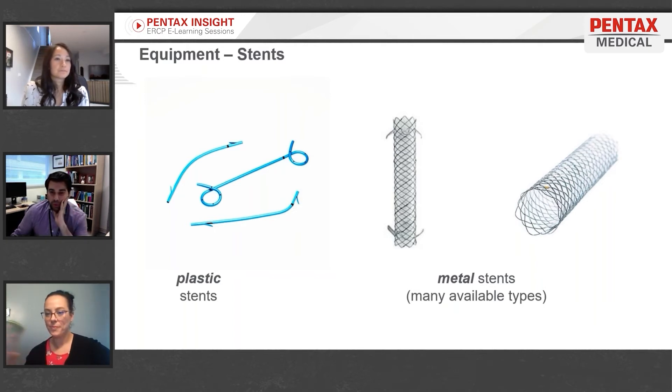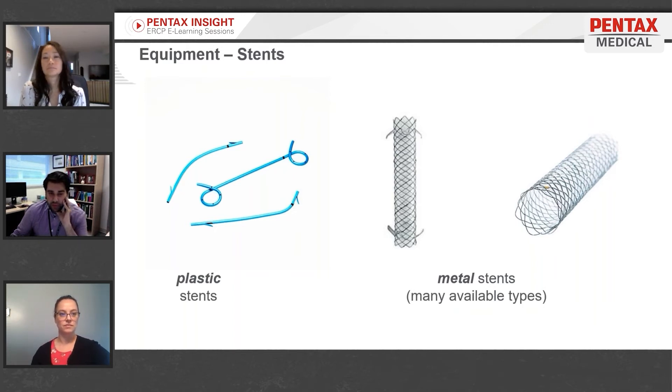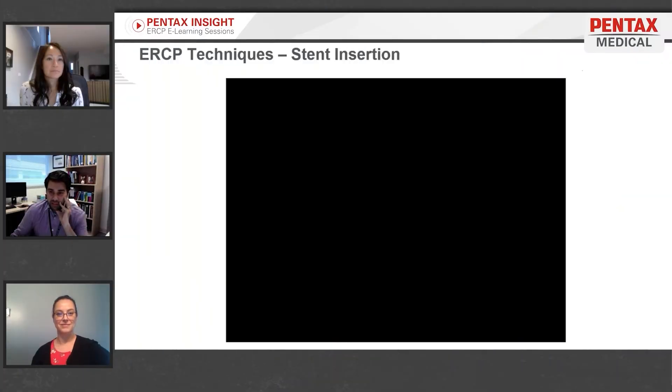This is ERCP 101 — there's tons of other equipment we won't cover today, just a basic overview of what you might encounter. Stents are simply tubes to keep things flowing where they ought to be. For biliary stents, they're designed to go around an obstruction — from stones, a stricture, or other causes. There are two broad categories: plastic and metal, with many different types of each.